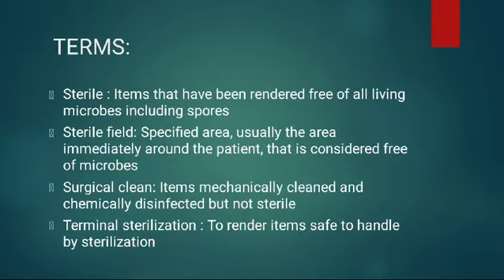Terms. These are some important terms in sterilization. Sterile: items that have been rendered free of living microbes including spores. Sterile field: a specified area, usually the area immediately around the patient, that is considered free of microbes. Surgical clean: items mechanically cleaned and chemically disinfected but not sterile. Terminal sterilization: to render items safe to handle by sterilization.